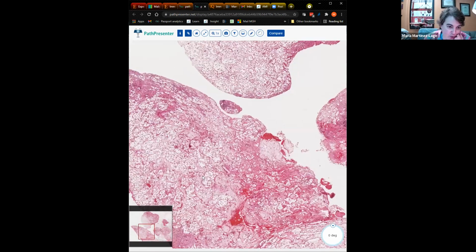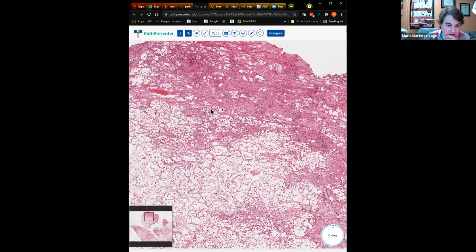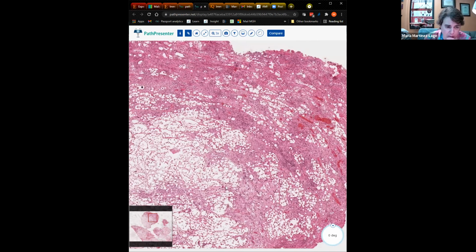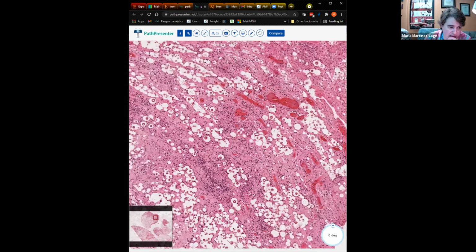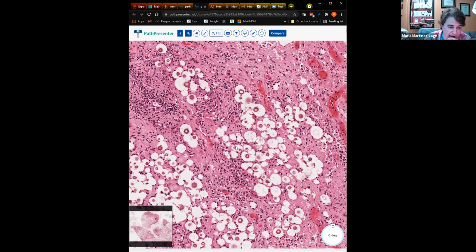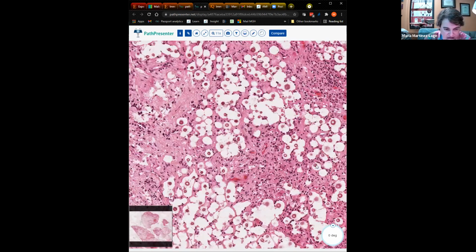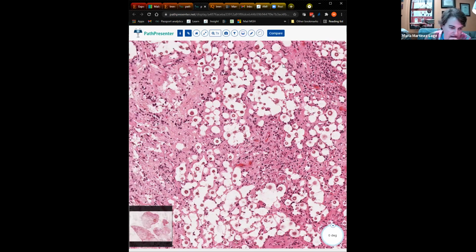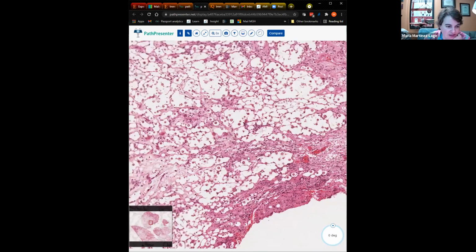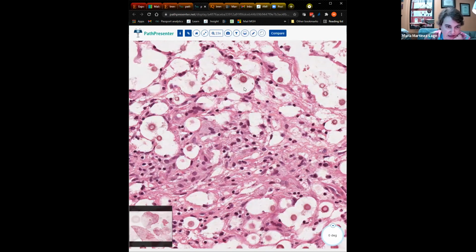This is a disease that more frequently than not occurs in patients that are immunocompromised, very frequent in the era of the AIDS epidemic. And what we're going to see are usually these, again, very rounded organisms with a capsule. I think this might not be an H&E, I don't know, because they're very visible, and most H&Es are hard to see. So I wonder if this is a different type of stain. There's obviously a sea of organisms here. For people that are not familiar, every one of these forms with a very well demarcated capsule is a cryptococcal organism.